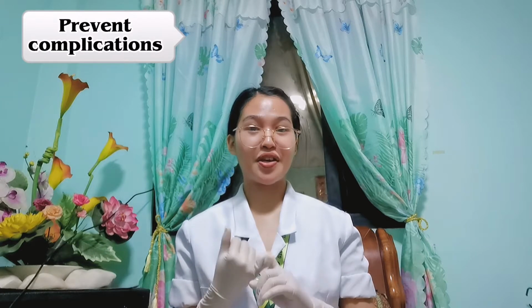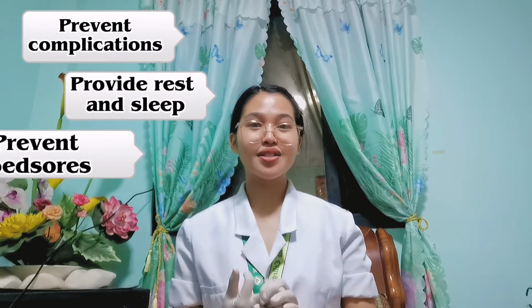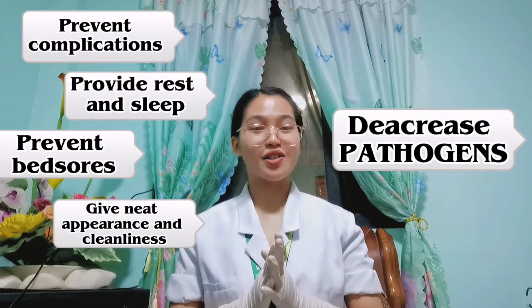Pablo Colleges, and for today I am going to show you the proper procedures of changing an unoccupied bed and occupied bed. The main purposes of bed making are to prevent complications by ensuring comfort and security to the patient, to provide rest and sleep, to prevent bed sores, to give the unit a neat appearance and cleanliness, and mostly to decrease pathogens in the patient's environment.